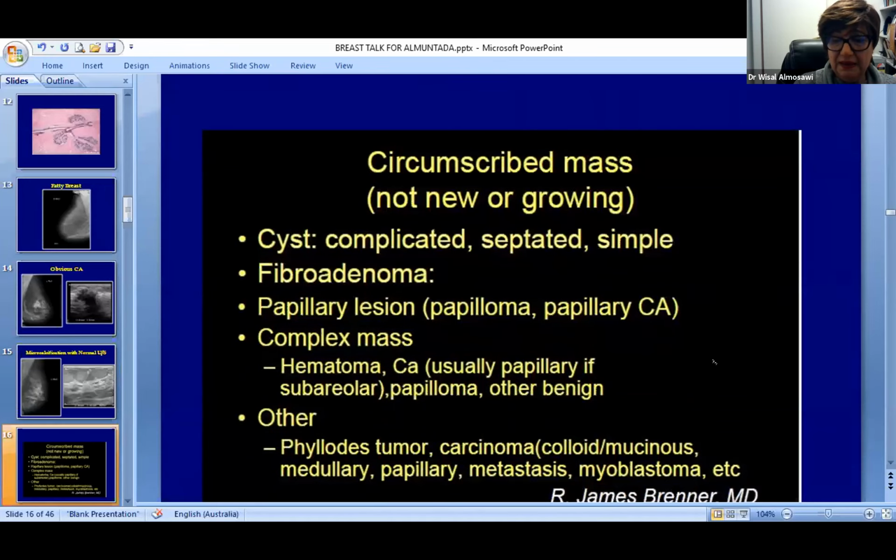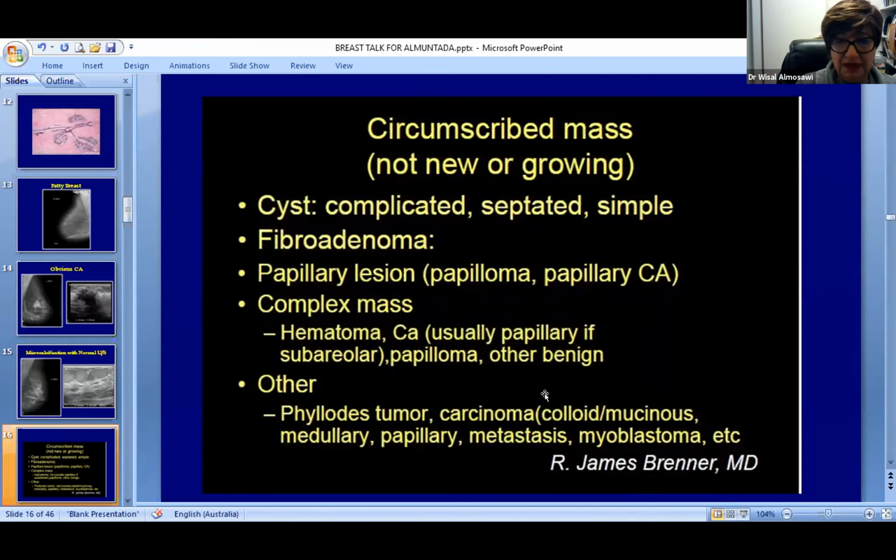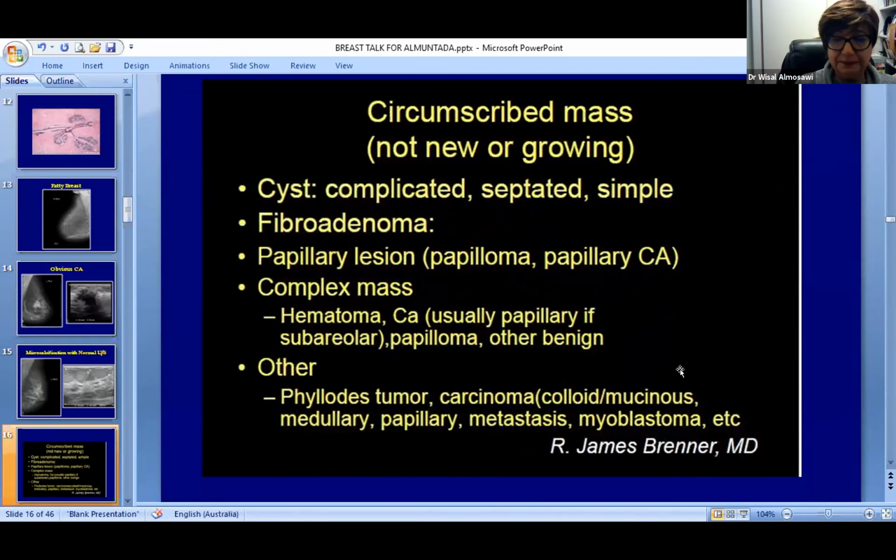Breast lesions could be circumscribed or non-circumscribed. The circumscribed or the rounded one, well-defined margin, this is your friend. This is usually benign. It's a cyst, it's a fibroadenoma, it's probably hematoma or sclerosing adenoma. But that's not always the case. So not always when you see a well-defined lesion, it means benign, because phyllodes tumor, medullary tumors, papillary tumor can look very well defined, and they can be very misleading.